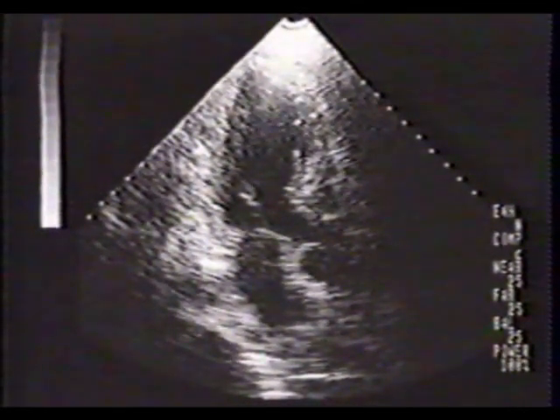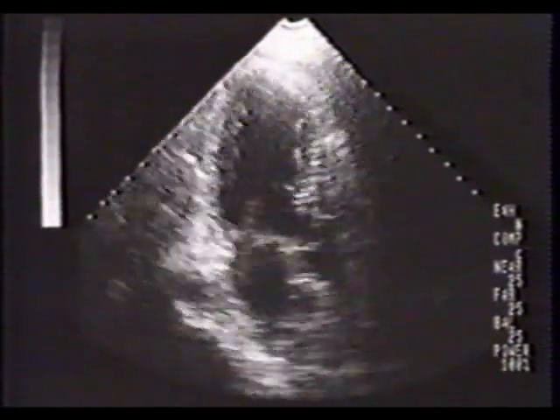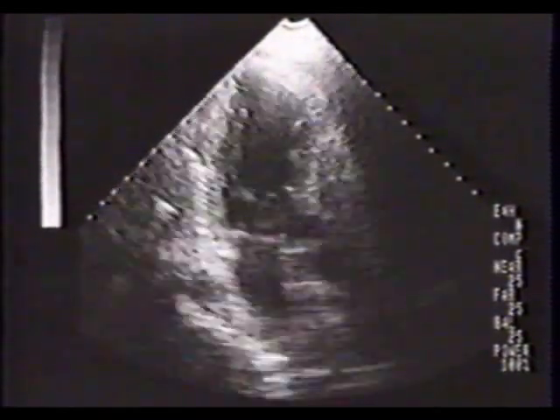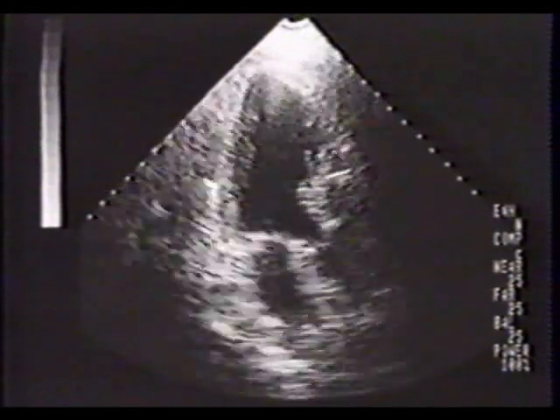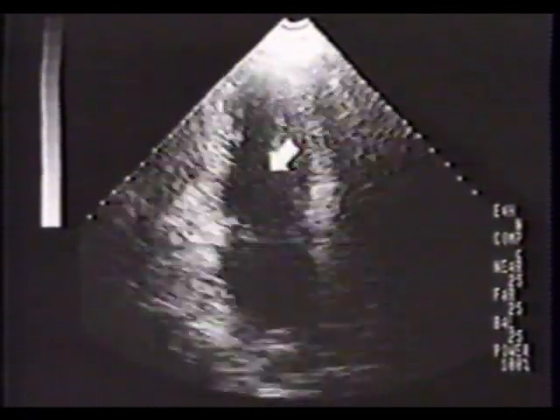It is in better focus on this apical long axis view. This is the base of the muscle. The head of the muscle has completely separated from the base. In real time, the head will flail back and forth during the cardiac cycle. The ruptured papillary muscle is also nicely seen in this apical two-chamber view.